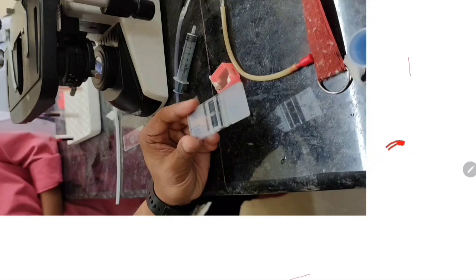Here you have to touch, just here. Where? Between the cover slip and the slide. Slide means the platform, the Neubauer slide, and the cover slip. Touch at this angle between the Neubauer slide and the cover slip, and automatically this drop will go inside this whole area by means of capillary action. Capillary action will pull the fluid inside the chamber, and the chamber will fill.